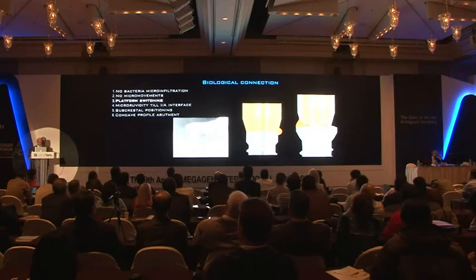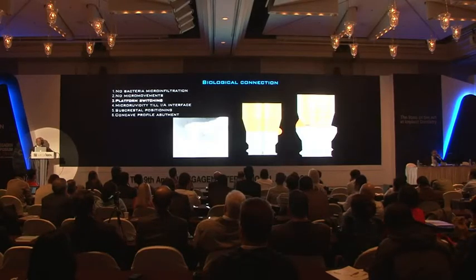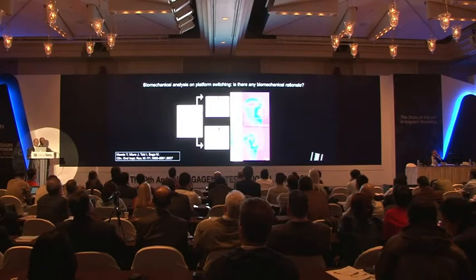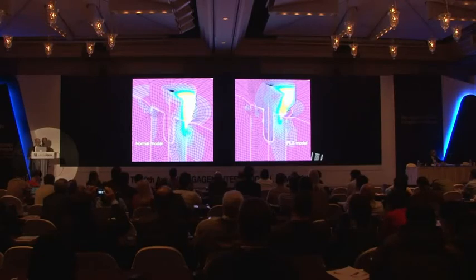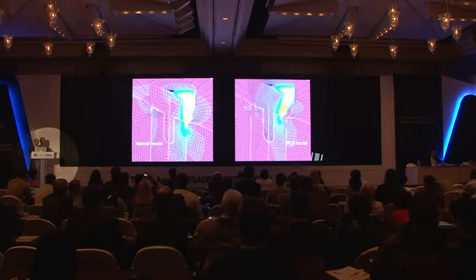This is the presence of a platform switching that has the biological function of shifting the possible gap far from the bone, and mechanically to concentrate the load far from cortical bone, following the inner part of the implant, like we can see in this study, where it is evident from this finite element analysis how the load is concentrated in the middle of the implant on the right, platform model, while on the left, that shows a normal model, it is concentrated at the implant cortical bone interface that can realize a bone overload at that point.